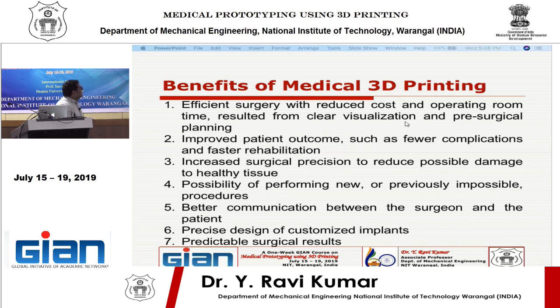So we can even get very good visualization or pre-surgical planning on these models, and of course it will improve the patient outcome. So you may have fewer complications and faster rehabilitation. That is another advantage you are going to get once you take this 3D printed route, and it will increase the surgical precision to reduce the possibility of damaging the healthy tissues. This is the important underlying thing. So he or she should not damage the healthy tissues.